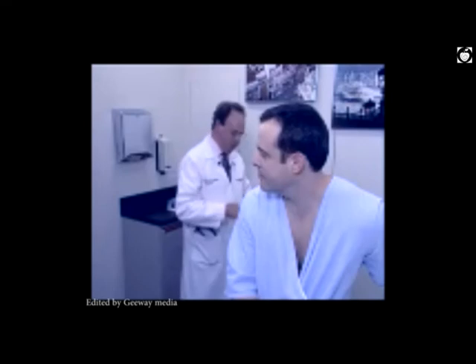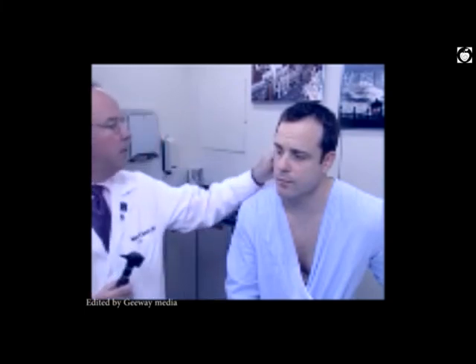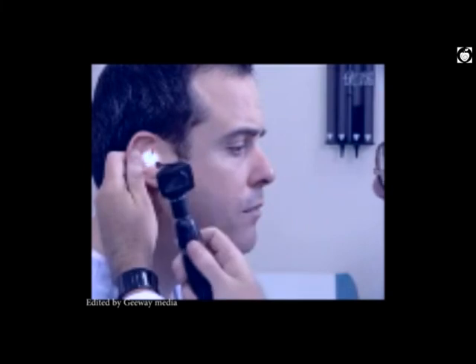I'm now going to demonstrate the otoscopic examination. The otoscopic head is put onto the handle, and the speculum, the largest diameter speculum, is used. In order to visualize the patient's tympanic membrane and external auditory canal in the right ear, the examiner places his left hand on the mastoid process and pulls up, out, and back, thereby straightening the external canal. The instrument may either be held this way to enter the canal or this way. Either way is acceptable. The most important part, though, is pulling up, out, and back to straighten the canal.